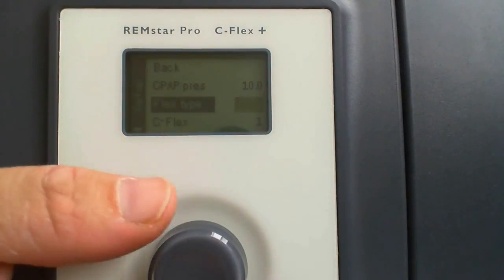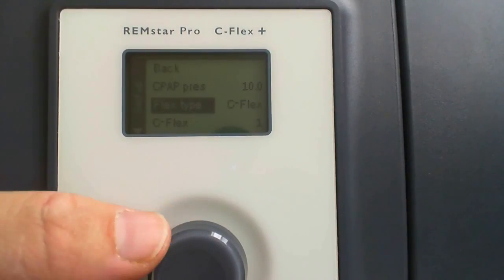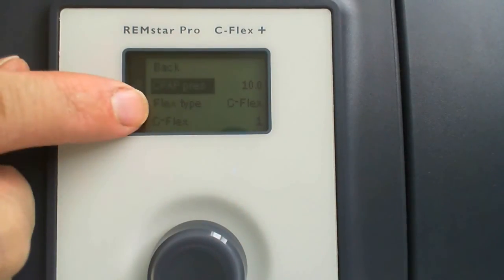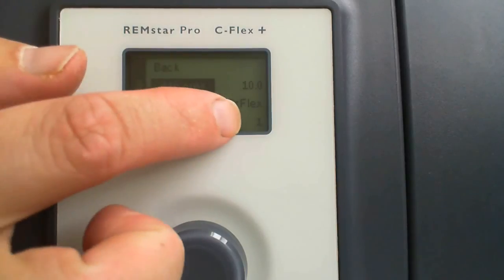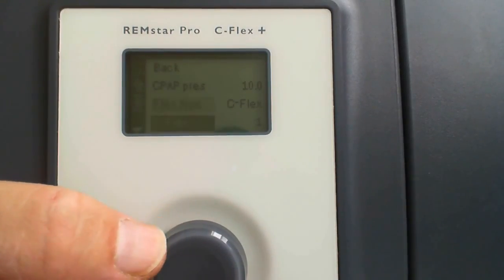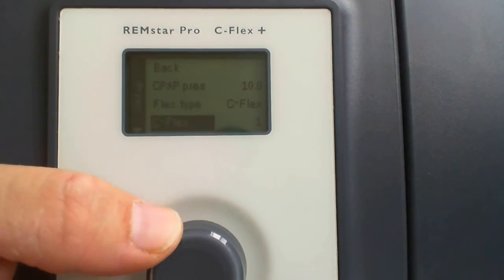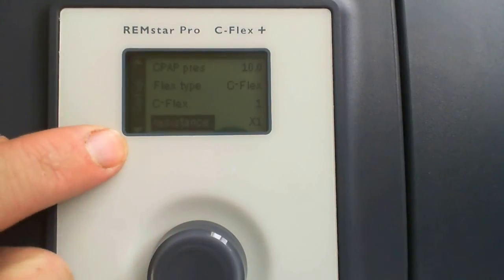Now, if you have none selected, it's not going to show up in the patient's menu. So if you're not seeing any flex type, now you aren't able to change this in the patient's menu, but if you aren't seeing any of them, it's because this setting is set to none. And the same way with this, if you set this to none, this next C-Flex setting, that little line will just totally disappear.